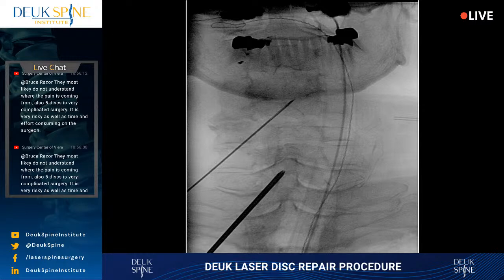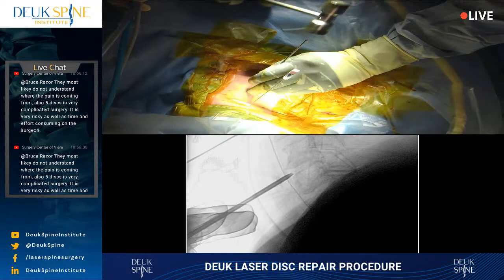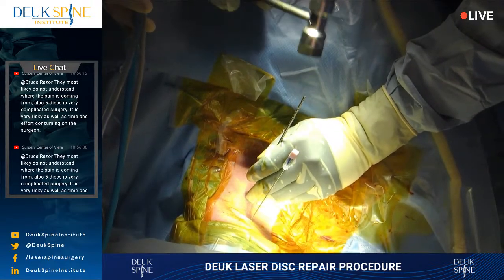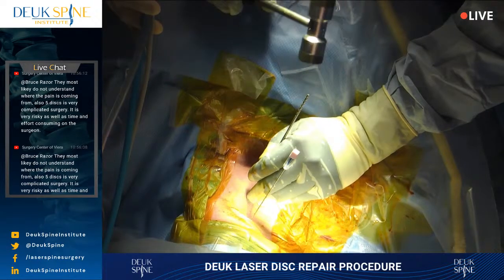So, I'm right at the front of the C5-6 disc. Nobody move. Give me a quick lateral. I need to get into the disc. Gently, carefully. Shot. Shot. Yes.